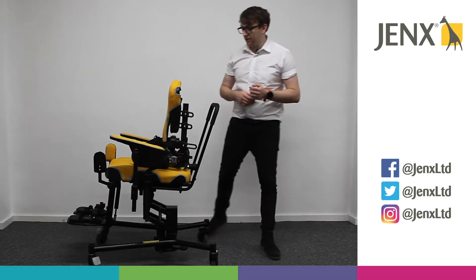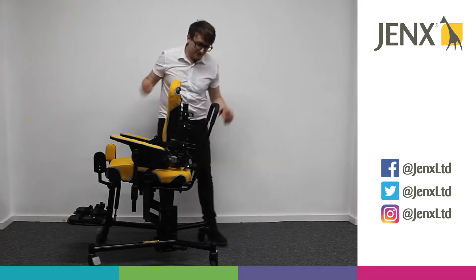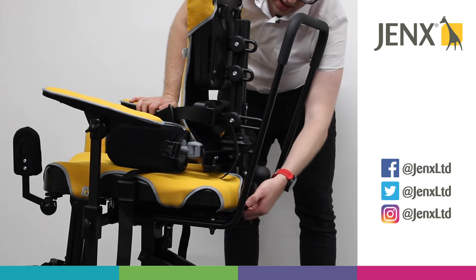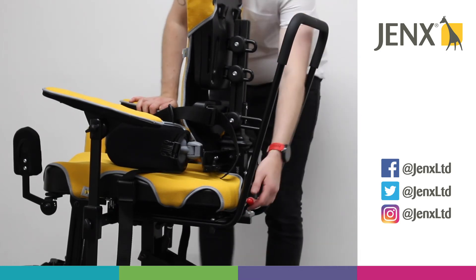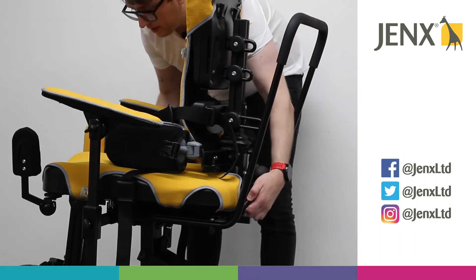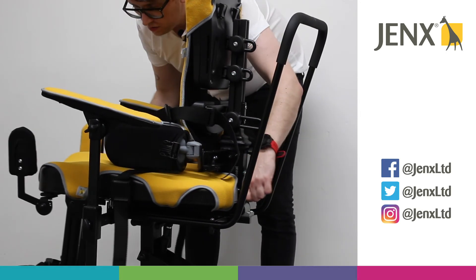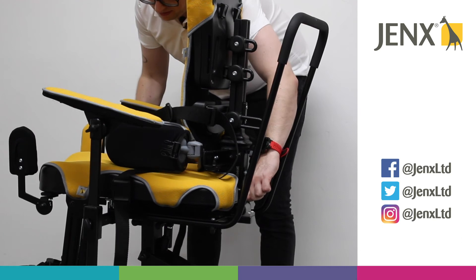If you're looking to adjust the seat depth on the multi seat, the mechanism can be found at the back of the chair — it's this black lever here with the red ball on the top. All you need to do is turn that lever in towards the chair, and then you are able to move the seat depth to whatever position you need it to be in.